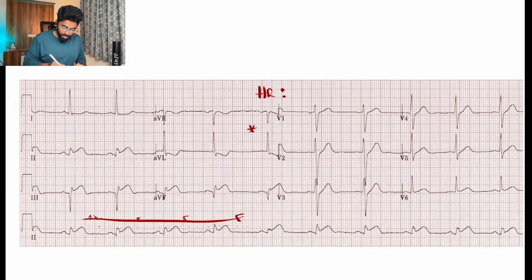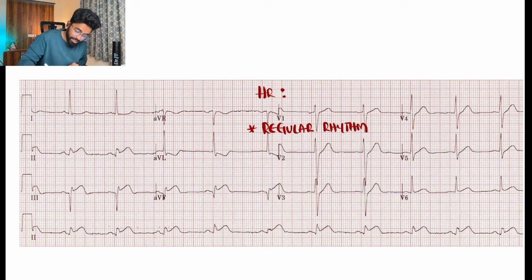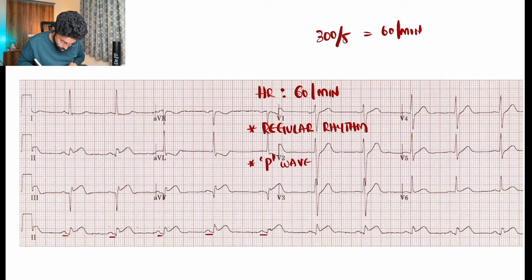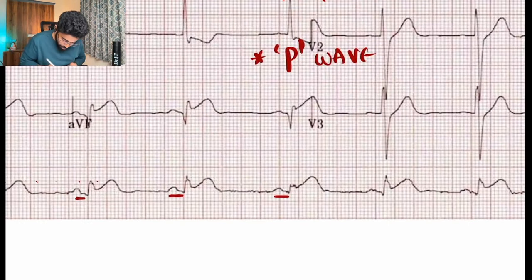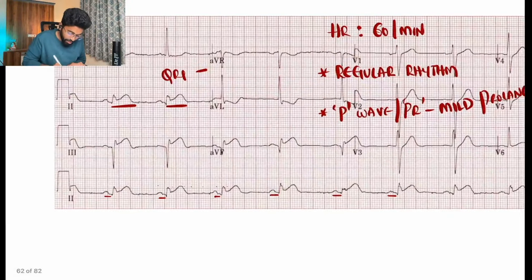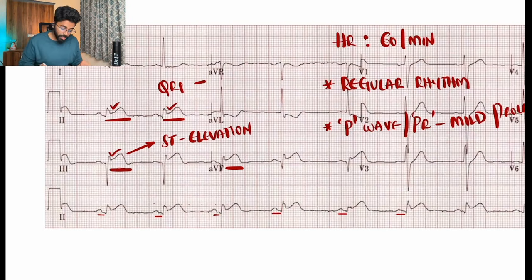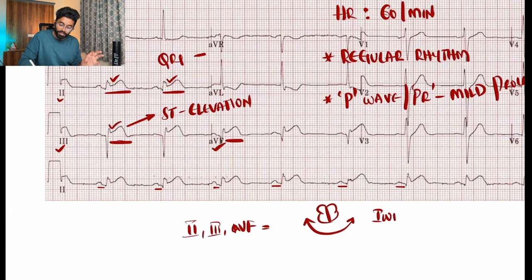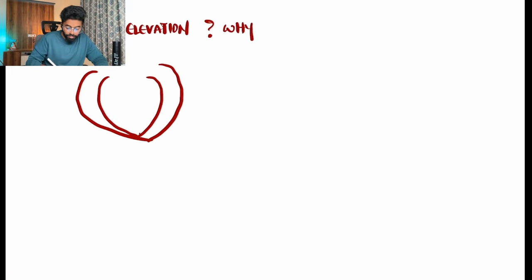For this ECG, we calculate heart rate as 300 divided by 5, which is 60 per minute. The rhythm is regular. The P wave and PR interval are present but abnormal — the PR interval is occupying more than one box. There are also changes in QRS and clearly visible ST elevation in leads 2, 3, and AVF, so this is an ECG of inferior wall MI.